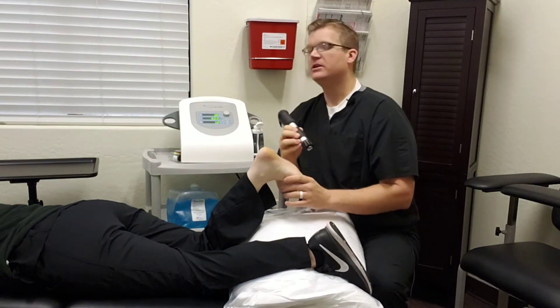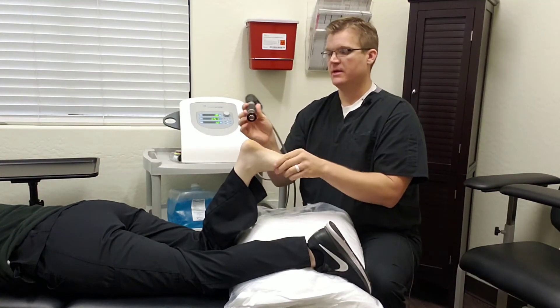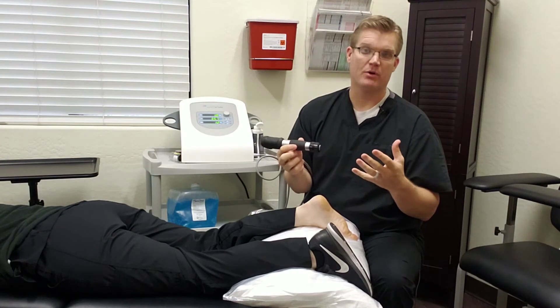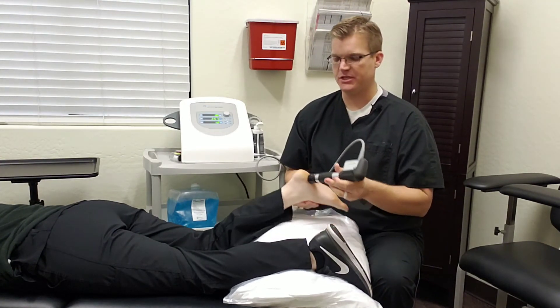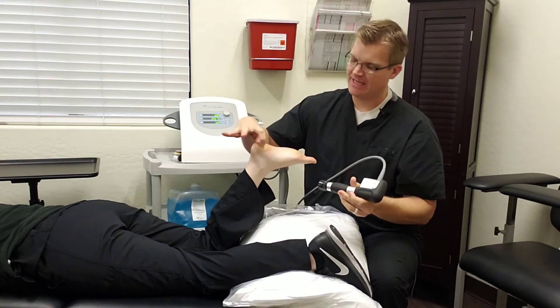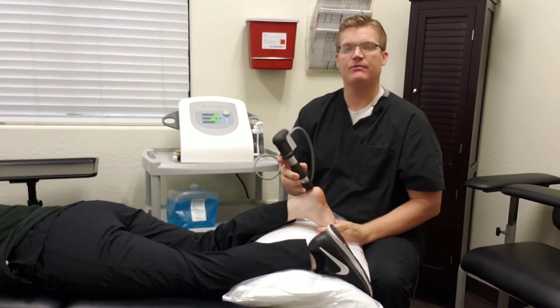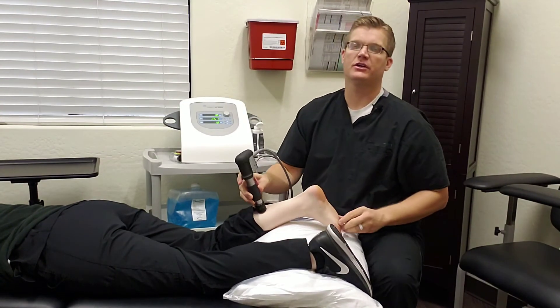Chelsea, you doing okay? There is some discomfort, but overall this treatment decreases pain and breaks down the scar tissue that's been creating the underlying problem. Most commonly it's held right at the base of the calcaneus, usually on the inside of the heel, and then we also work on the Achilles tendon insertion through here and work with the soleus and gastrocnemius muscles looking for trigger points.